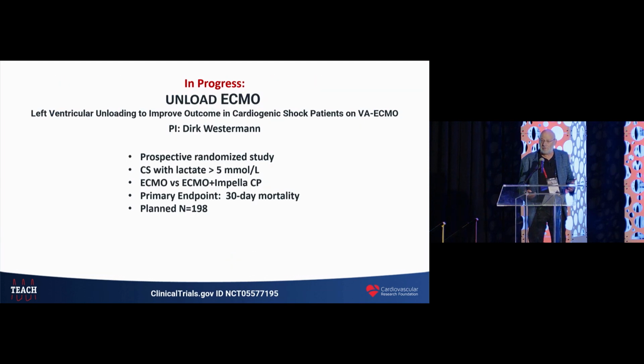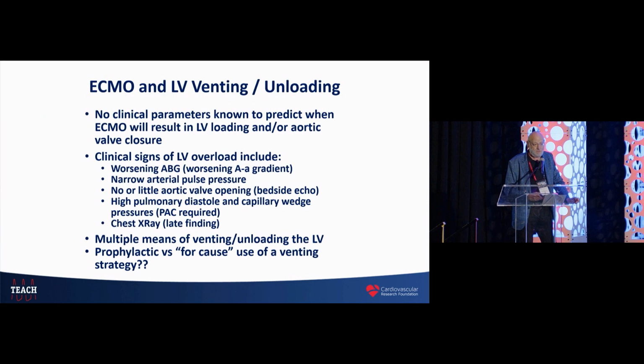Really, the only study that I'm aware of right now that is in progress is the Unload ECMO study. This study is a prospective randomized study in patients with severe shock with lactates greater than 5, and it's comparing ECMO versus ECMO plus Impella up front, with the primary endpoint at 30 days and intending to enroll 198 patients.